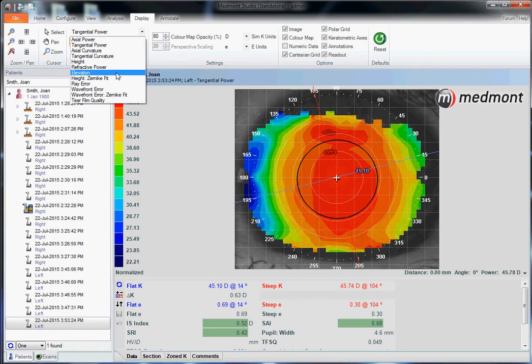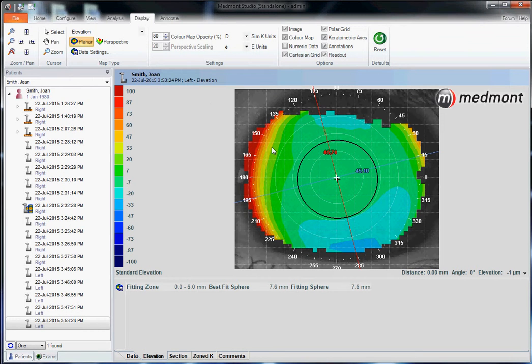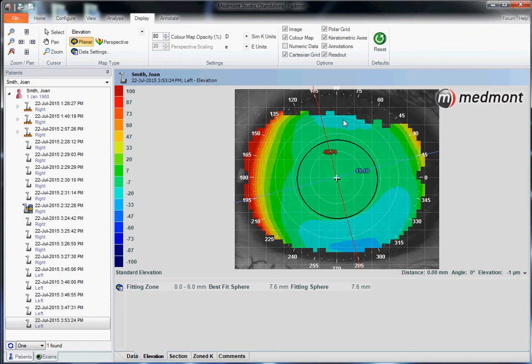We can pull up an elevation map to understand where the eye is high and where it is low. Red indicates where the elevation of the eye is high; blue indicates where it is low. Dropping a rigid contact lens on this patient, it's going to hit at the high elevation red areas and lift where you see the blue at twelve o'clock and six o'clock.